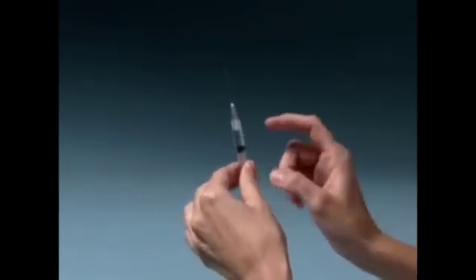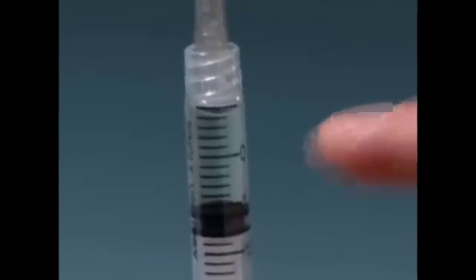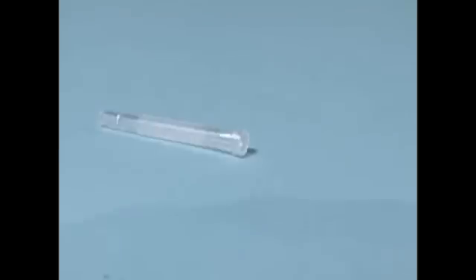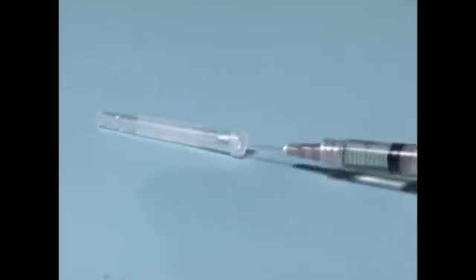To remove any air bubbles in the syringe, point the needle upward and gently tap on the syringe. When all bubbles have risen to the top, slightly press the plunger until a small drop of solution appears at the tip of the needle. Re-cap the needle.